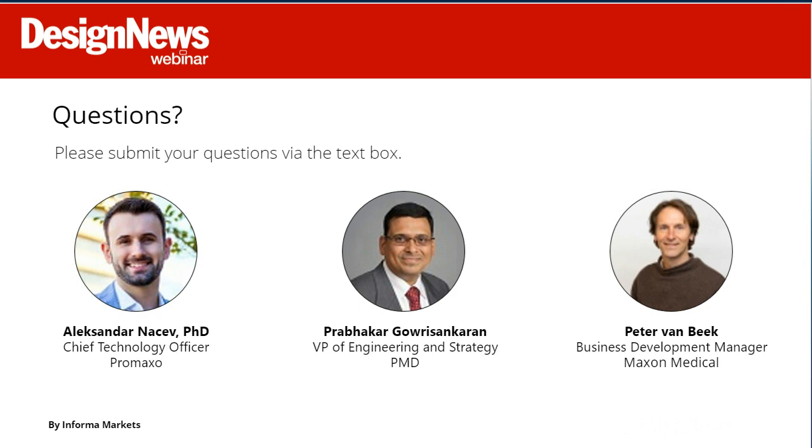Not sure, Prabh, if you have anything to add to that, or Alec, if you have seen anything. Yeah, I think we've seen our end machine designers, the medical designers, do enclosures that are completely autoclavable. That way they can use electronics from anywhere. We see that in aerospace and defense applications too, where they make an enclosure that's IP rated, and that way they can take off-the-shelf electronics and put it in. So we've seen that in some applications. And from our side, we try to keep the number of components that need to be autoclaved or sterilized to a minimum, so that it's an easier clinical workflow. But it is critical to have those types of technologies that you can sterilize.